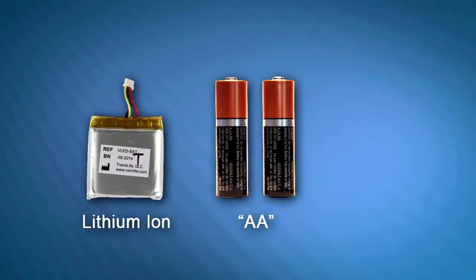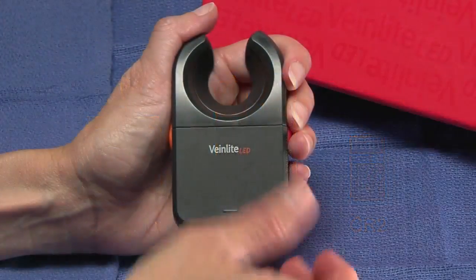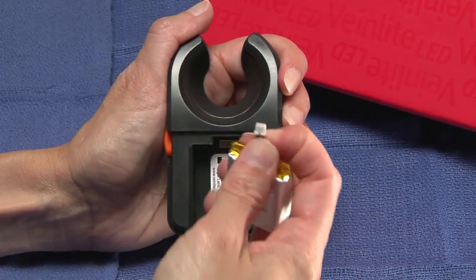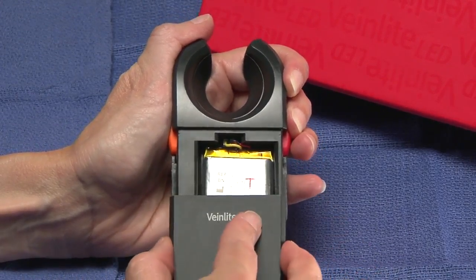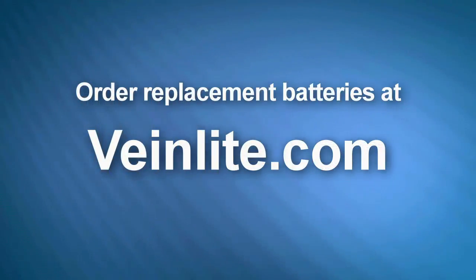Replacing the lithium ion, AA, or CR2 batteries in your VeinLight device is fast and easy. Simply slide the cover off and lift out the battery. Some rechargeable batteries will have a wire connector that must be removed too. Replace the old battery with a new one and slide the battery cover back on. You can order replacement batteries for your device at VeinLight.com.